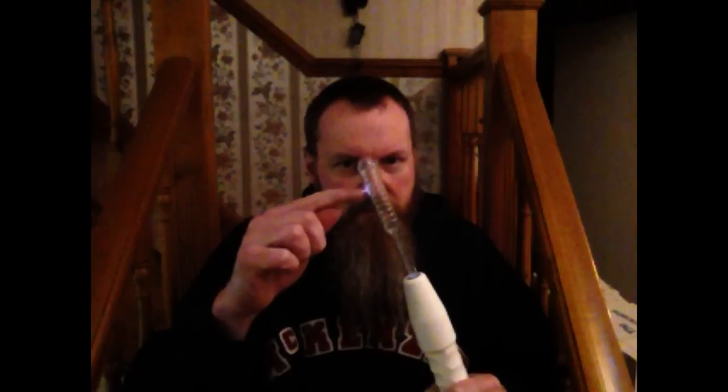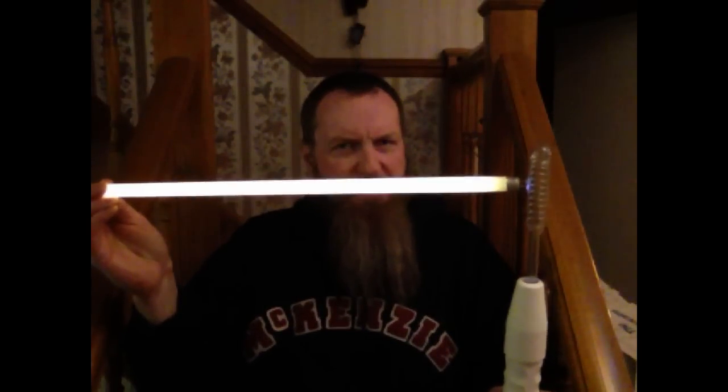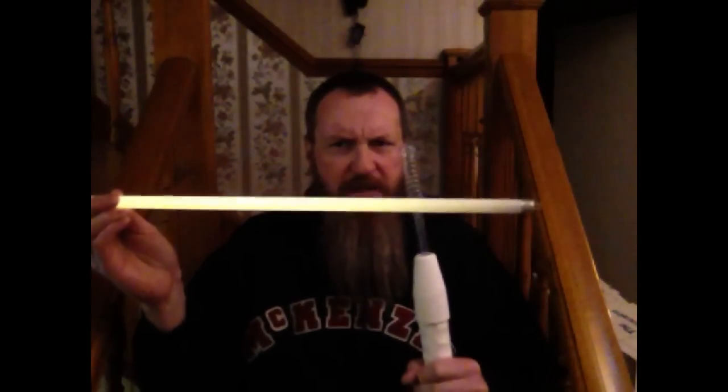Can we make it more dangerous than just sticking glass up your anus? Yes! We can energize it at tens of thousands of volts of RF energy directly referenced to the mains. Oh look, there's loads of light now. In fact, there's loads of light even when it's not anywhere near it. That's quite scary actually.